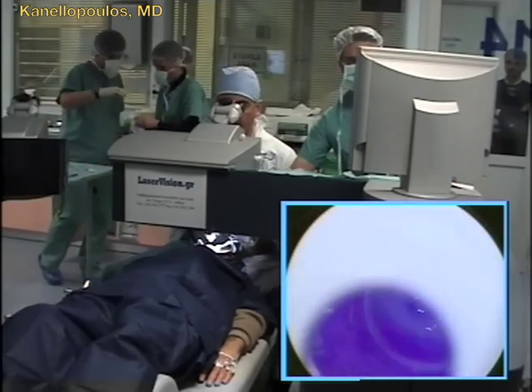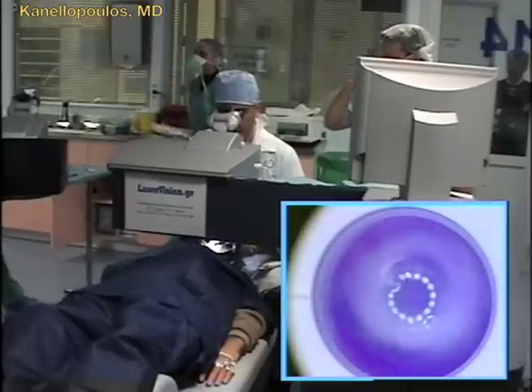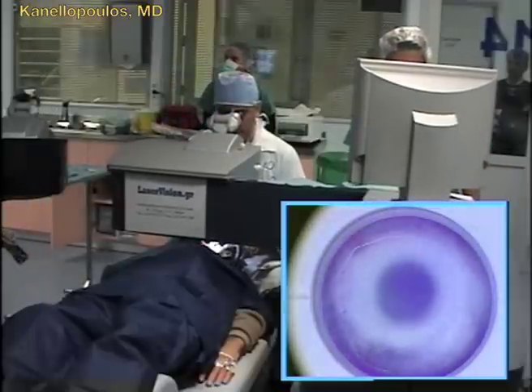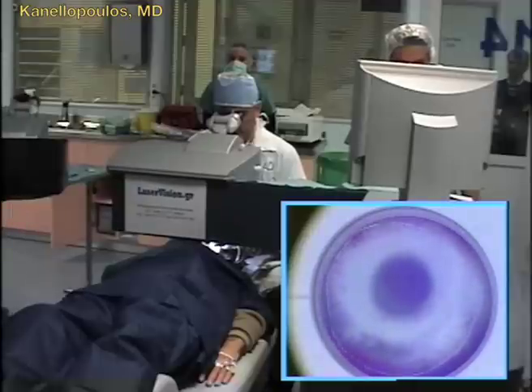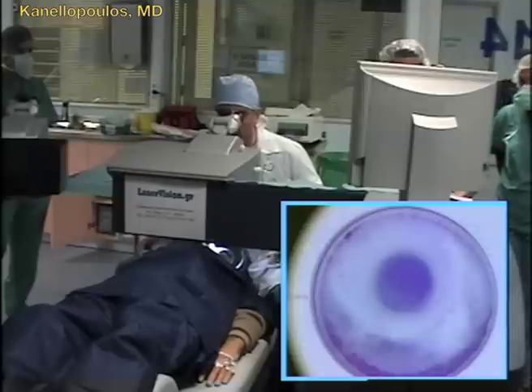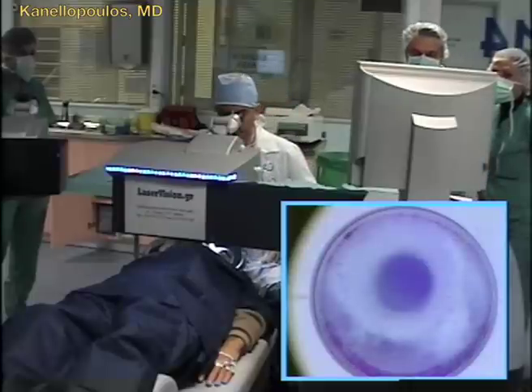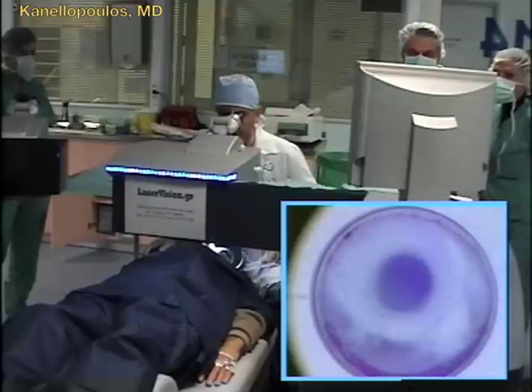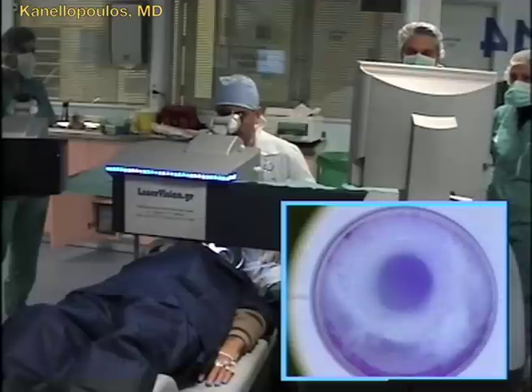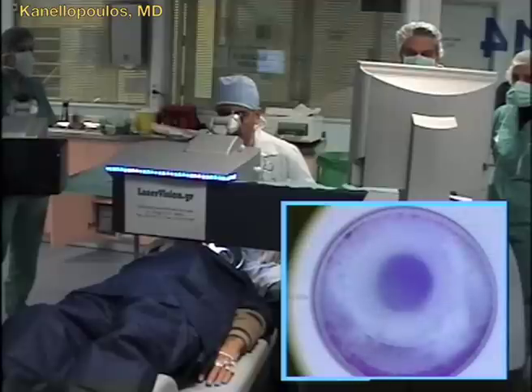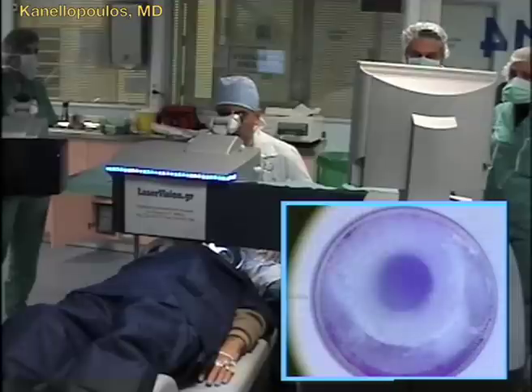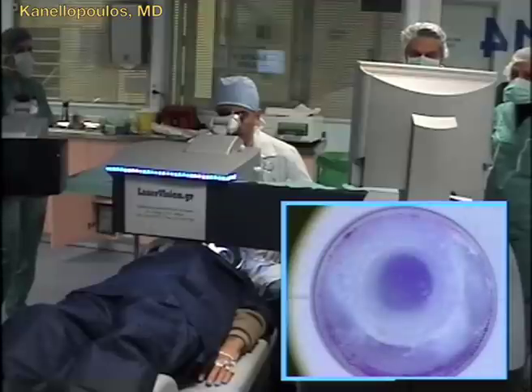This is a failed graft, so we will go with the FS200 patient interface seen here. This is done under peribulbar anesthesia, and we will applanate the patient's cornea. We will see where the old graft interface is, and we will apply the zigzag pattern. You can see here it starts from posterior coming up to anterior, centered on the patient's pupil. The diameter is 7.5 millimeters, very eloquently done by the femto, and this is real-time trefination by the femto.